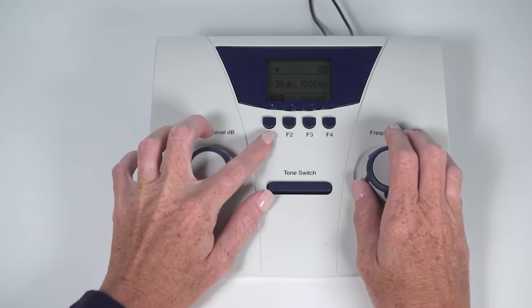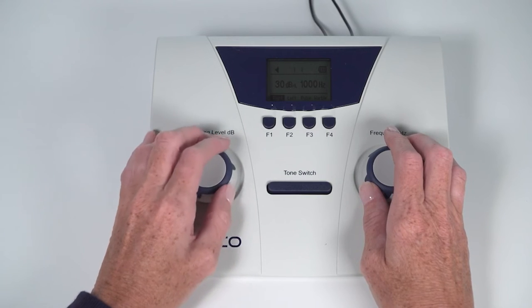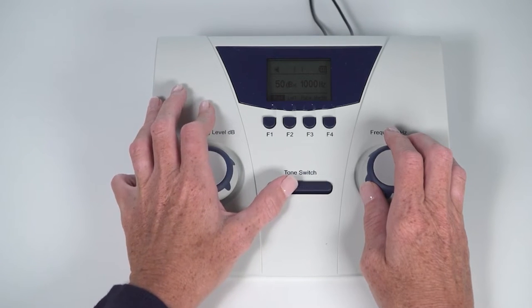Select the right ear, select the frequency of 1000 Hz, and select a volume level of anywhere between 40 to 60 dB HL. This level is used to condition the child to the test signal so they know what to listen for during the actual hearing screening test. Press the tone switch one to two seconds to present the tone.